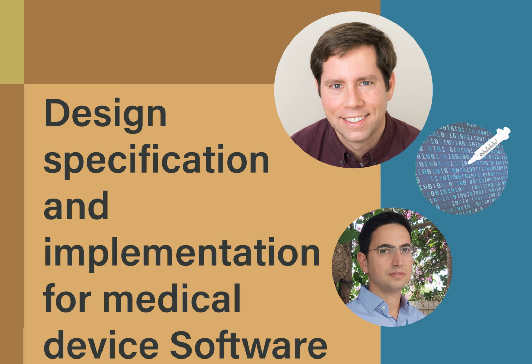For a medical device startup, it's not going to make sense to generally invest that much in automating system tests. It's difficult to do, but companies that are design firms that do this a lot, or larger medical device companies with a product line that maybe has a bunch of different variations, very high volume, maybe coming out with new versions every so often, I think those kinds of companies can really benefit from investing in automating those system tests. The more you can automate, the better.